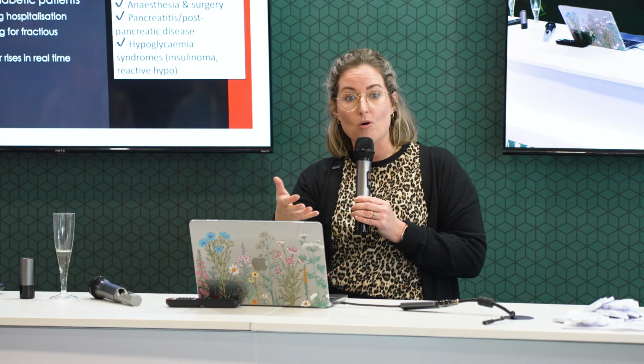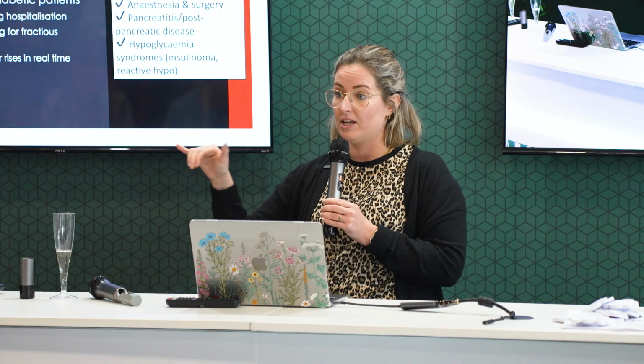We also know with this group of patients, if they are diabetic and have a GA, they may have a period of instability after that general anesthetic. And so actually this will then allow ongoing monitoring at home in that period where we're getting over that anesthetic and that stress of that hospital visit.